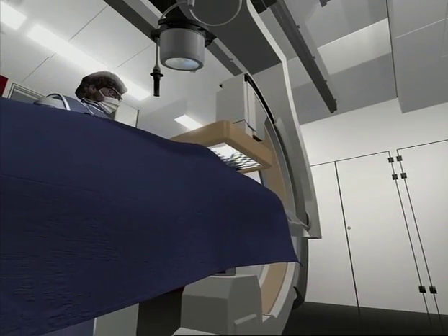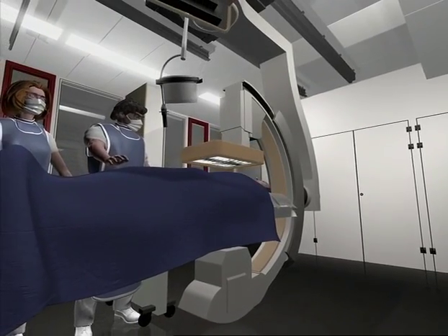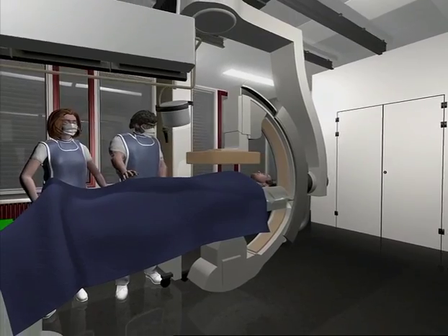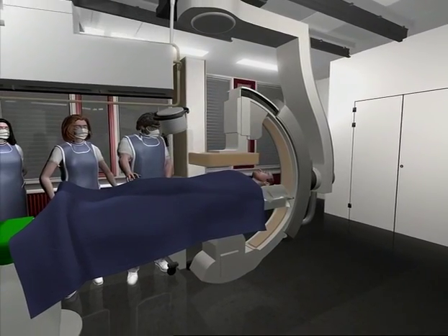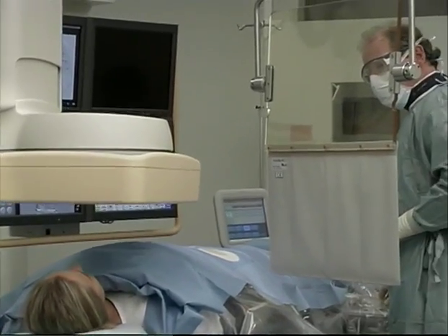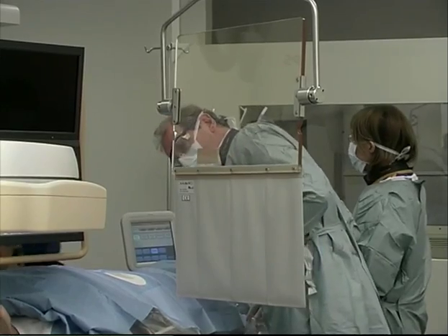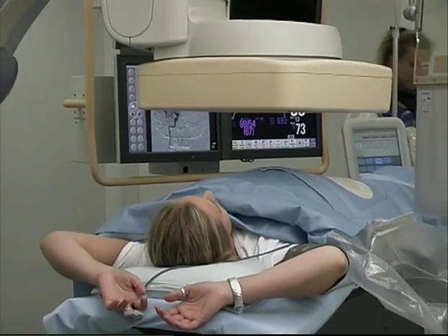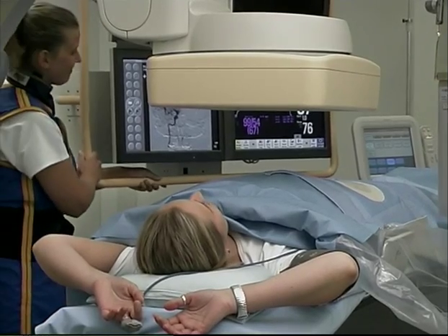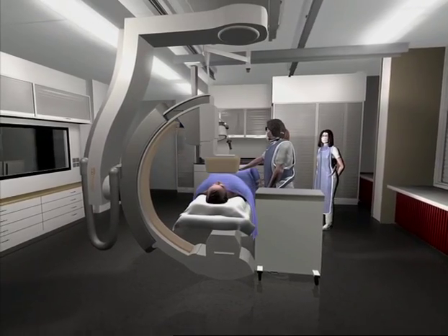The following instructions should be followed for the highest level of protection against unnecessary radiation exposure. Adequate preparation is required before each intervention with the X-ray system to ensure correct patient positioning and procedural planning. The X-ray system should be positioned as optimally as possible. It is important to check that the equipment to protect the patient is used properly. Sufficient protective equipment should be available.